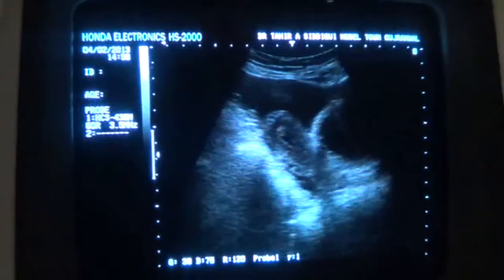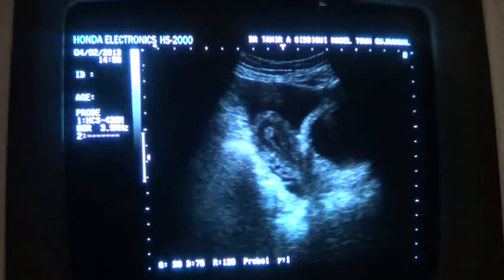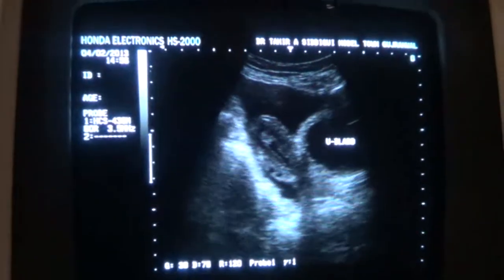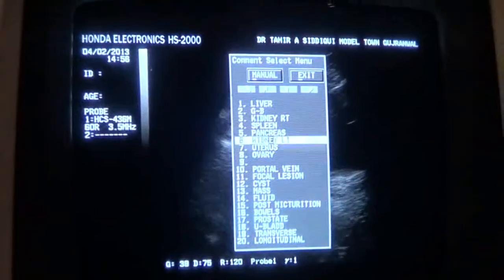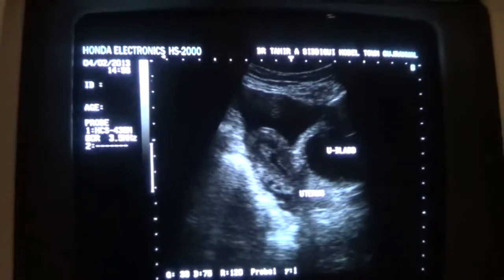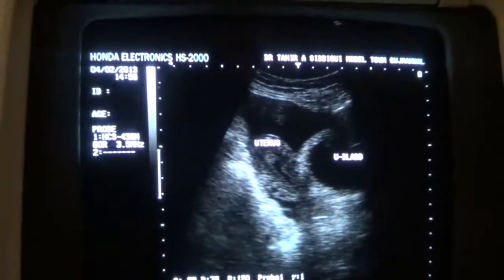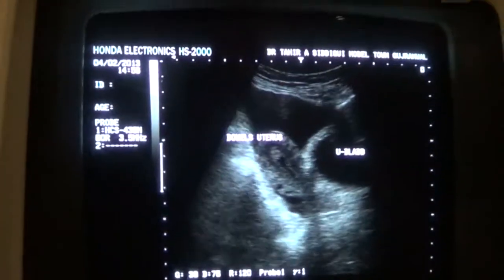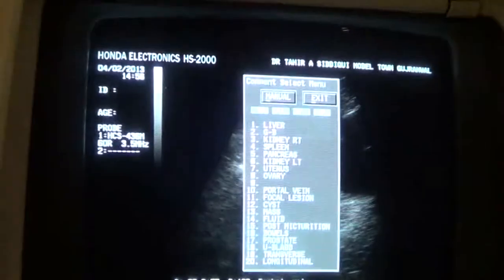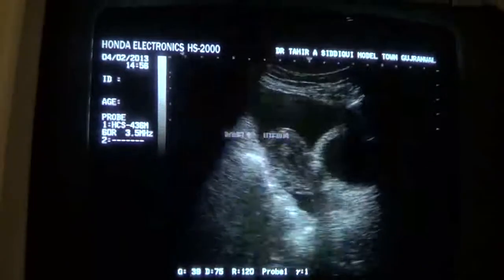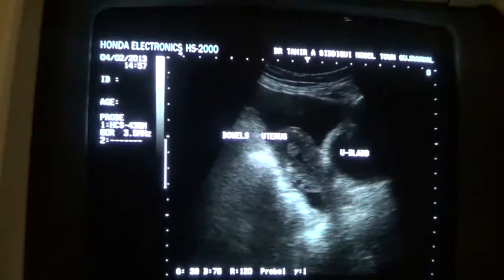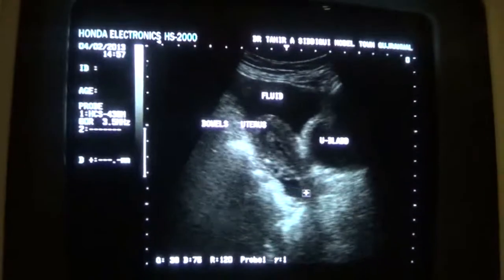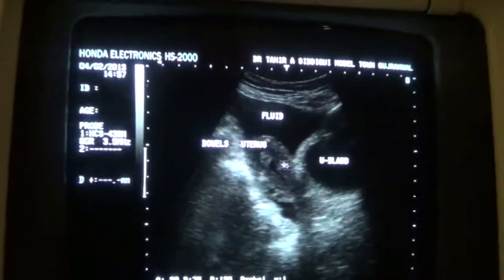On screen is a female pelvic scan. This is the urinary bladder, this is the uterus in longitudinal section, and these are bubbles floating in ascitic fluid. This is the ascitic fluid, and we are seeing the uterus through the ascitic fluid. This small slit-like black area is also fluid.